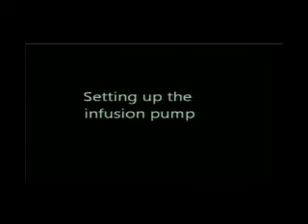If infusions of drugs are used, they are almost always done with a pump. A pump is a mechanical device that allows you to set the rate very precisely. The pump has to be set up very carefully so that it knows everything it needs to know about the drug, like what is the drug, how concentrated is the drug for many kinds of pumps.